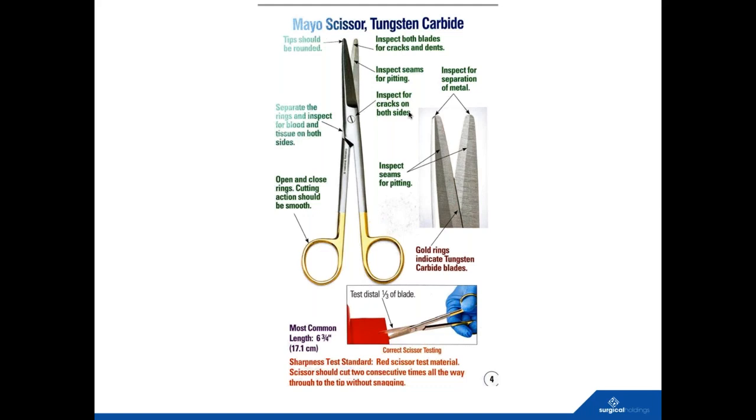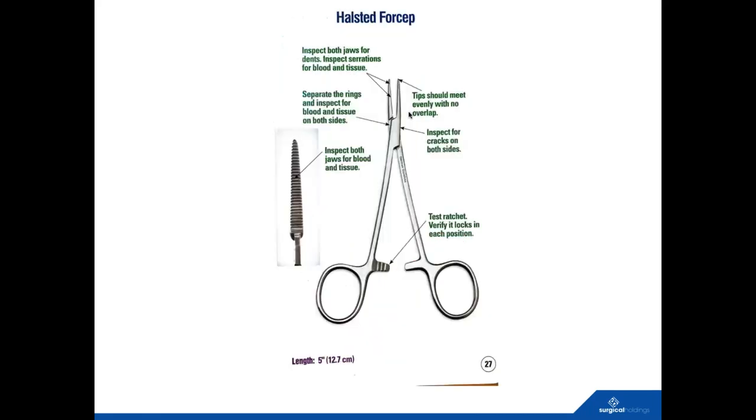Yeah, no, I agree. I think there's a worry of liability. You know, once someone's signed off a scissor and says it's cutting because they've tested it on some material, but I think it's always with a disclaimer that, you know, you're assuming because something could happen to the scissor somehow once it's in the tray. So, you know, you can only do as much as your procedure that you lay out to test the scissor, and providing that's evidenced, then I think that should be sufficient cover to not put people off doing it.